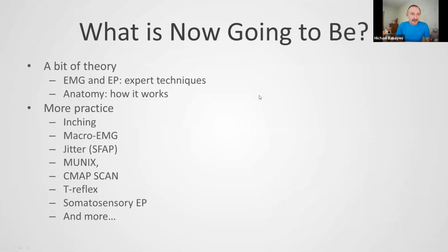What is going to happen now? At first, a bit of theory, when I'll tell you about expert techniques and how it works inside the human body. And then there will be more practice, when our doctor, Evgeny Gulayev, will show you some expert techniques on a real patient.